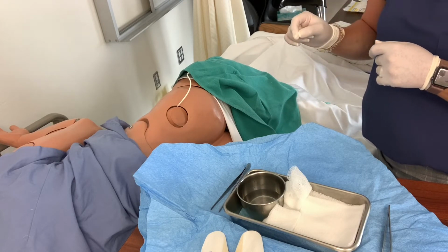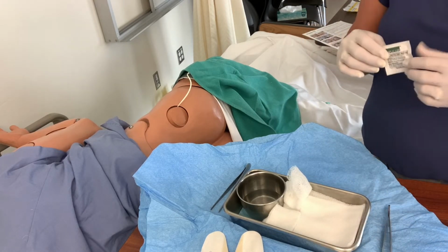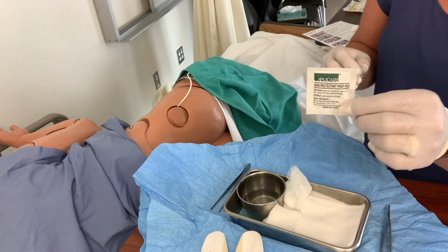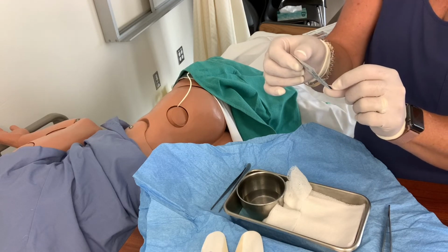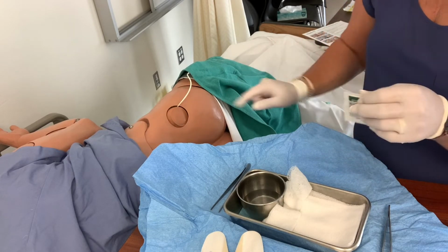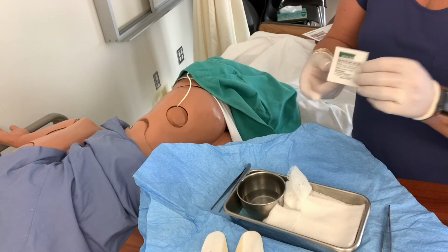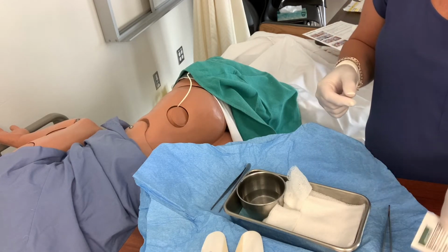And what I want to do now is prep the skin. I want to get ready to put the StatLock device back on, and there is a skin protectant pad there. I am not going to use that on the mannequin, or I'll never get this off, but it's just like an alcohol swab. You just apply the skin protectant to clean, dry skin, and allow to dry before applying the bandage. So you're going to rip that open, figure out that you want your StatLock right around here, wipe that area with this little alcohol swab, and let it dry. Okay, I'm just going to set that back down.